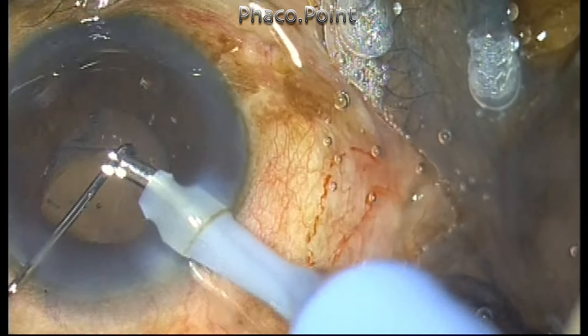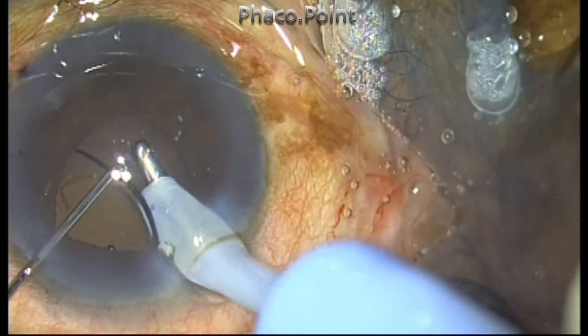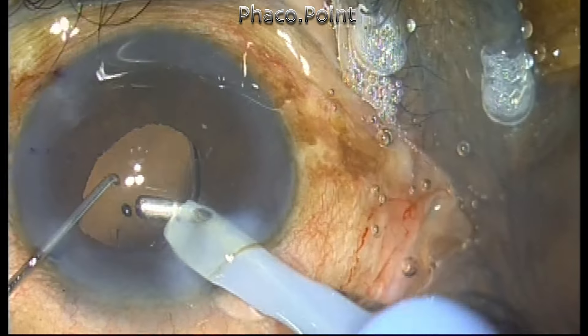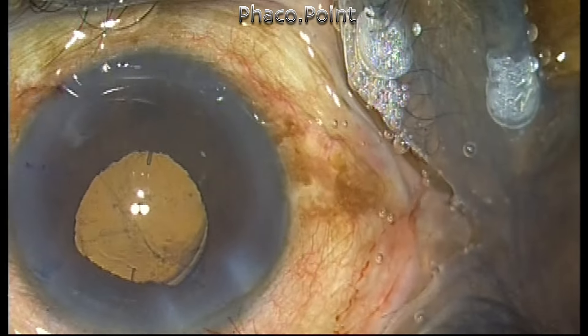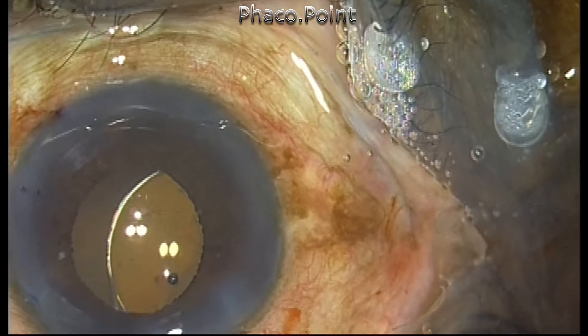It was only when I tried to pivot rotate the lens that I found it was moving in a funny sort of fashion — flapping around. The reason I believed at that point was that the lens was partly in the bag and partly in the sulcus. It was also decentering, so I thought I'd like to center the lens by dialing it into the bag.